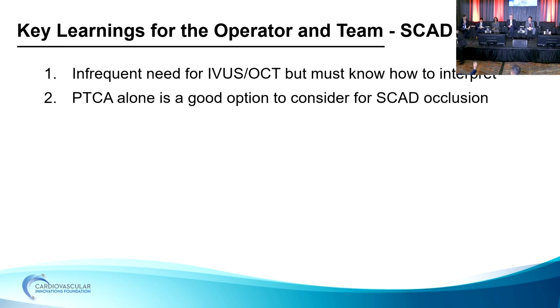Some questions from the audience? Yeah, I agree that you have to restore flow if it's a STEMI with ongoing pain. So once you get the wire, do you IVUS those to make sure you're in the true lumen? Because you could put a stent in the false lumen and have a problem. Yeah, I don't know is the short answer to that question. I mean, sometimes you can just tell, you're finding multiple septals, or if it's a workhorse wire, you just know. And trying to scrutinize an IVUS down there in the LAD in the middle of the night, you can maybe make mistakes on that. So I think, yes, if you're really in doubt, but usually you know if you're in a lumen.